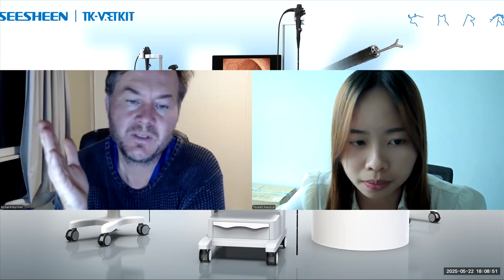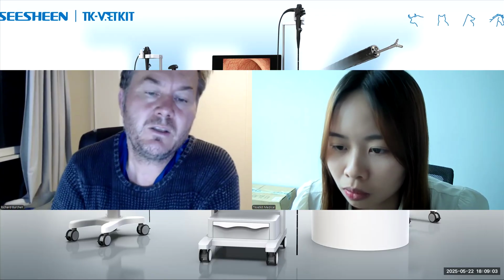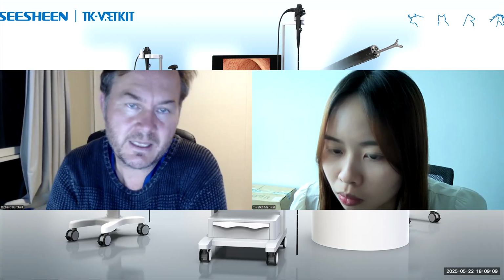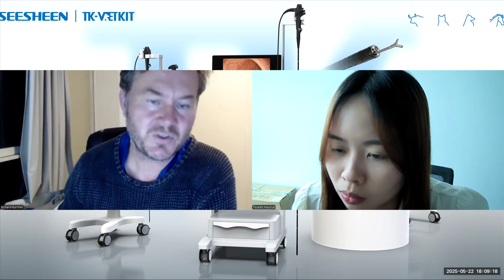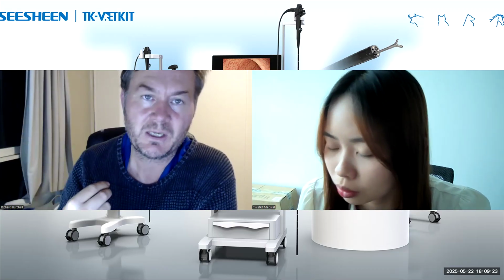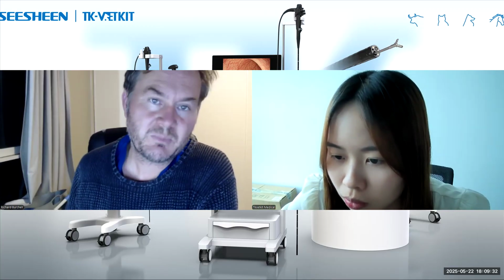I'm often not really doing these in critically unstable patients. I guess it's a very broad topic, because you might be doing an airway exam because you have a collapsed trachea and the dog is dyspneic, and under those circumstances you probably want to avoid anesthesia and endoscopy unless you have an emergency stent that you can place, because often you can't recover those cases once you've done endoscopy on them and they've been under anesthetic. So I generally avoid respiratory distress patients for endoscopy.